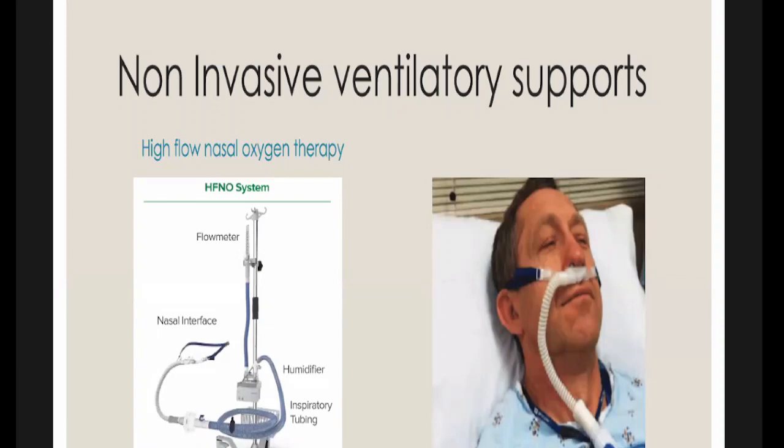So he looks very comfortable though, but what are the problems that can happen? With movement, madam, this device can detach. Yeah, the device can get detached actually, because it can fall off anytime, because it is just fixed around the ear, isn't it?